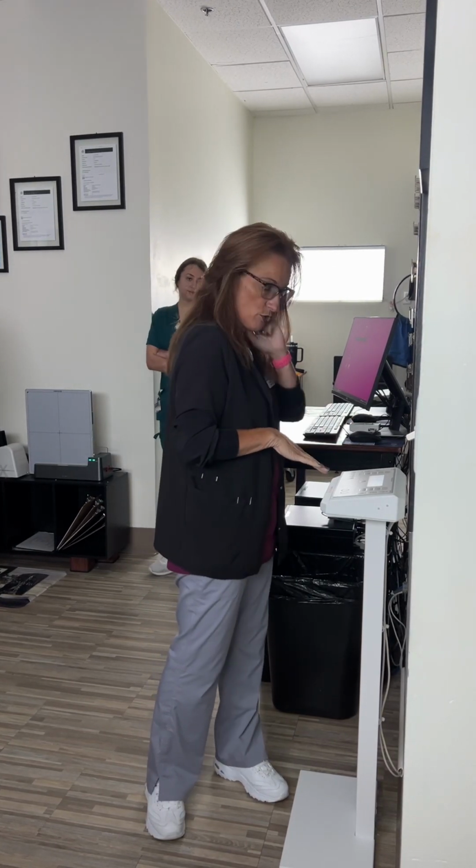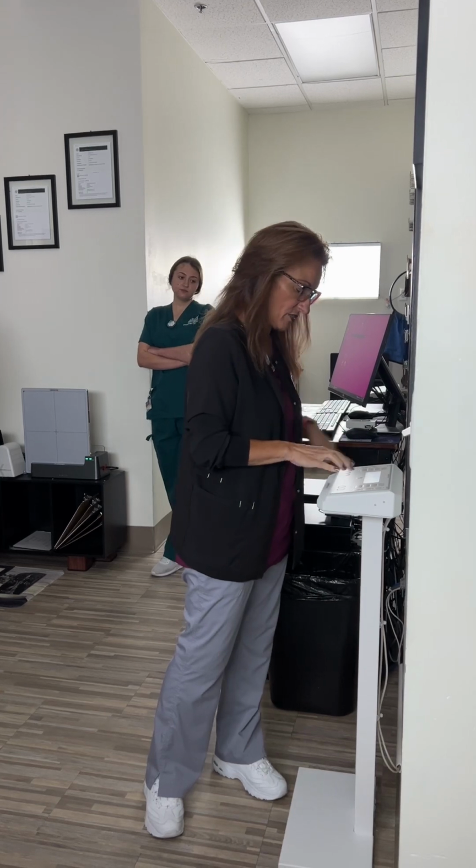All right, so we are going to demonstrate an upright abdomen on a hypersthenic patient. So we're going to do a crosswise image, and truly most of the time you can get one image upright for the crosswise. As long as the diaphragm is relatively in the top, you wouldn't need two, but there are some patients that truly could use two crosswise if you do it upright, depending on where the diaphragm falls on the first one. So we're going to set the control panel first because that always saves time.